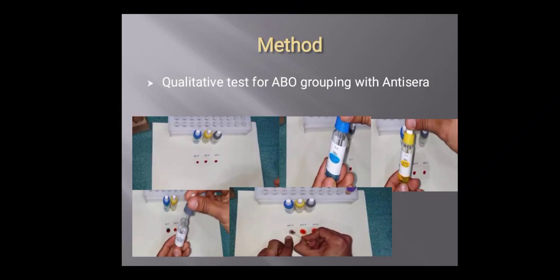First of all, what you have to do is you have to swab your index finger with the cotton balls which is dipped in spirit and take a blood sample with the help of a lancet.